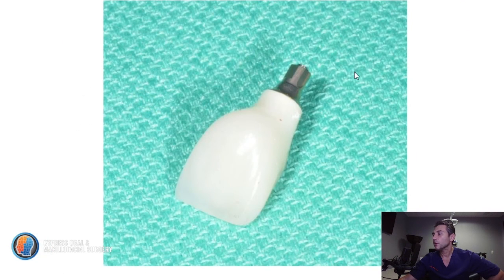Here's an example of one we did. This is a final restoration. It's a screw retained restoration. And again, this is not this case, but it's another patient, but notice how smooth and nicely transitioned the contours of the crown are. This gives perfect results.